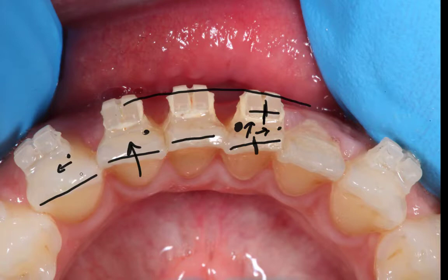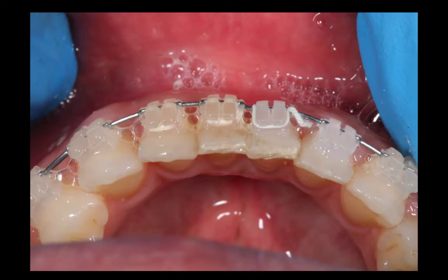But these two the patient's not really too concerned about. It's really this one which the dentist is having trouble with. So all I did was clean these two teeth up and rebonded a bracket onto them. So this is when it's all just been rebonded — just these two brackets, this one here and this one here. And now, can you see that there's a wire deflection? The wire goes in here and gets deflected down and is in the bracket slot there. So this little deflection here is going to actually want to straighten out — it's going to want to pull this part of the tooth out that way.